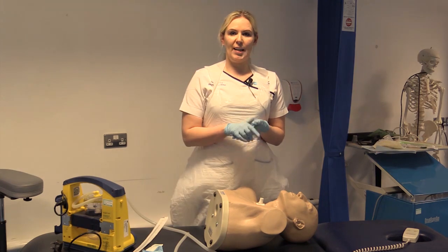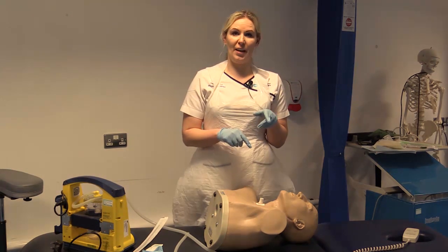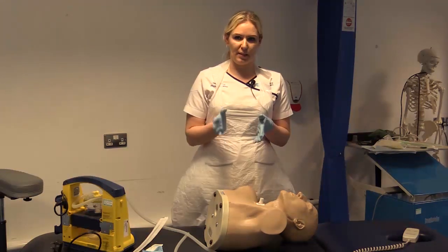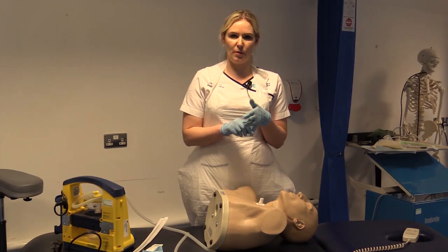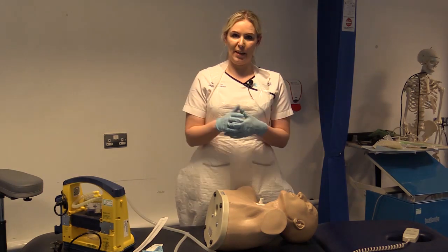So in this video we're looking at suction via tracheostomy, mini tracheostomy, and the same principles will also apply through a laryngeal stoma. Obviously the patient won't have a trachea tube in place, but the exact same principles apply. As previously, you've established your need for suction, you've checked your patient's medical notes, and you've gained informed consent where possible. You've washed your hands and you've put on your appropriate PPE.